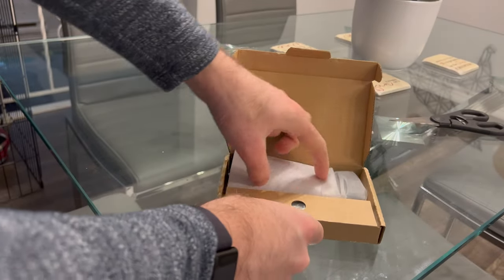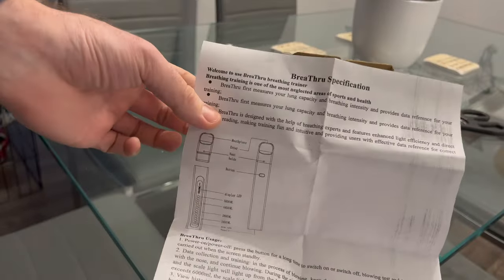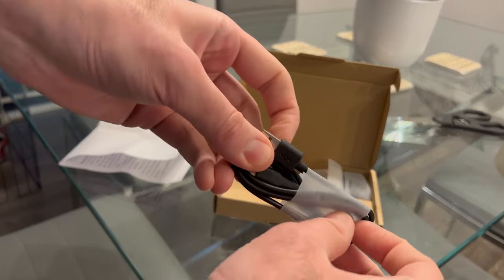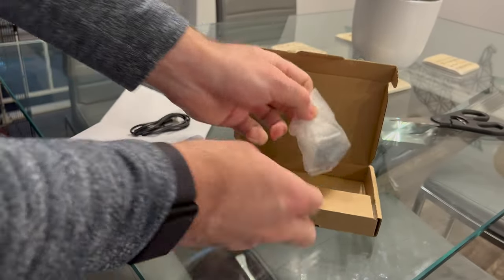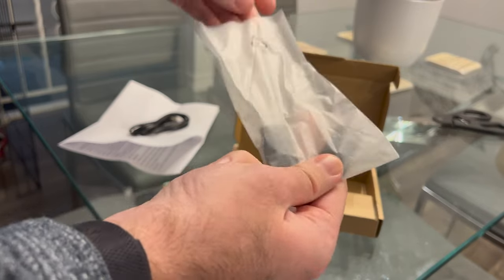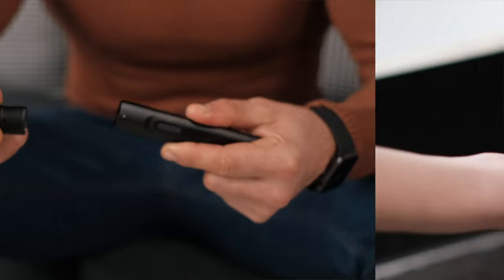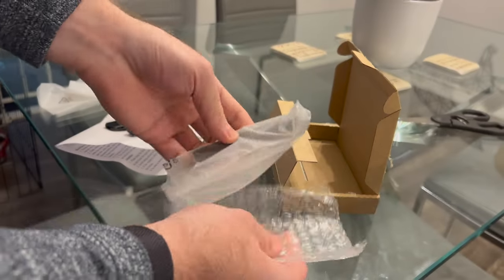In the box with the Breathe Through, when you receive it, you will of course receive a copy of the instruction manual. You also get a handy USB charger. It has an internal battery that allegedly lasts for about five months, which is amazing. You'll also receive two mouthpieces, which are totally washable and safe even for dishwasher use. And then of course you receive the unit itself.